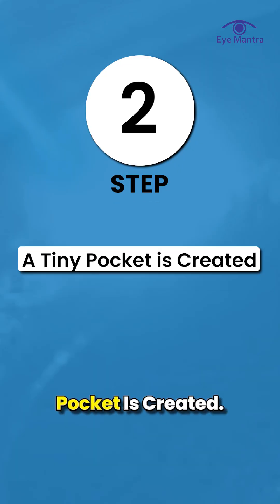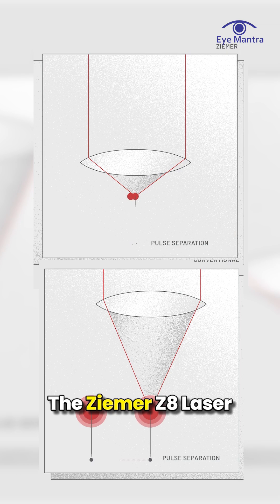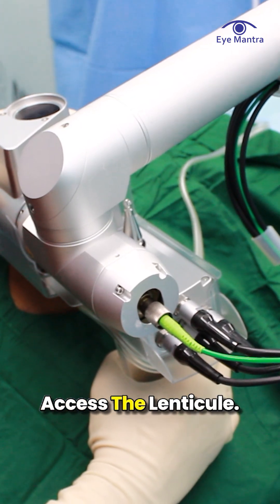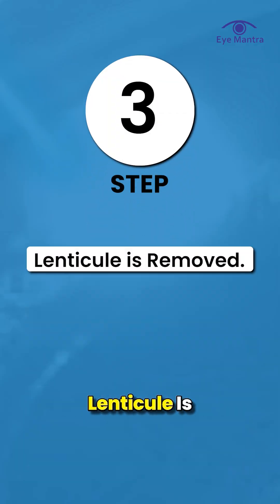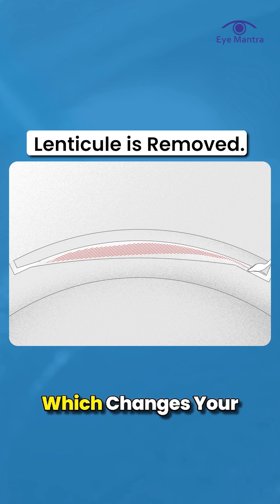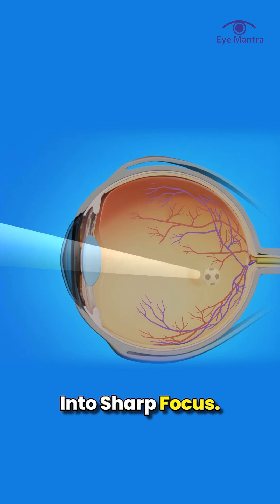Step 2: A tiny pocket is created. Then, instead of cutting a big flap, the Zima Z8 laser creates a small, 2mm pocket inside your cornea to access the lenticule. Step 3: Lenticule is removed. That lenticule is carefully removed through the pocket, which changes your cornea's shape and brings your vision into sharp focus.